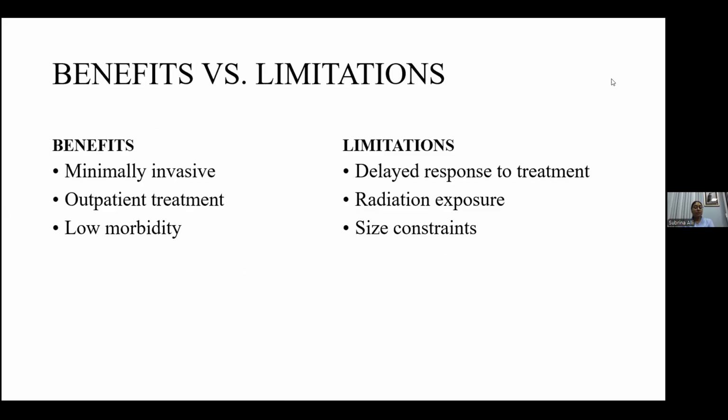So some of the benefits versus limitations. Benefits will include being minimally invasive. These patients have the option of doing this as an outpatient, and they not only have low morbidity, but low mortality as well. In terms of the limitations, they do have a delayed response to treatment, as we can see from the arteriovenous malformations' time for complete obliteration. They are exposed to radiation as well, and we do have some size constraints as we are not really applying stereotactic radiosurgery to tumors more than 3 centimeters in diameter.